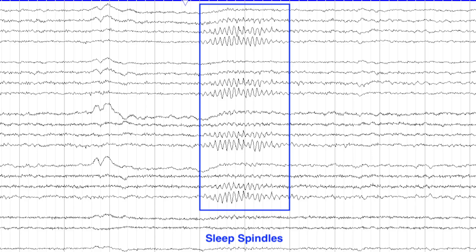Sleep spindles are high-frequency waves between 12 to 16 Hz, arising from the reticular nucleus of the thalamus. They are maximal in the central region at the vertex and occur in short bursts of waxing and waning, spindle or fusiform-like rhythmic activity. They are usually 20 to 100 microvolt waves and are features of stage 2 sleep.